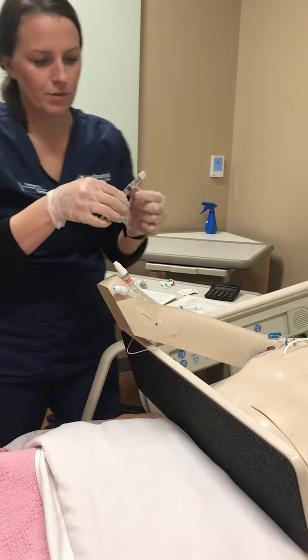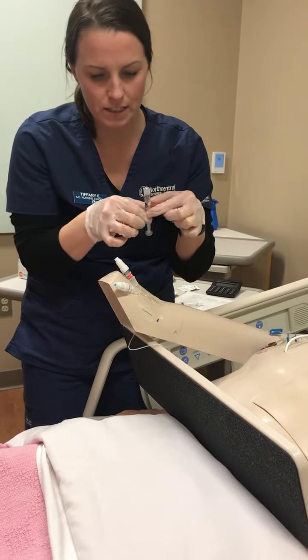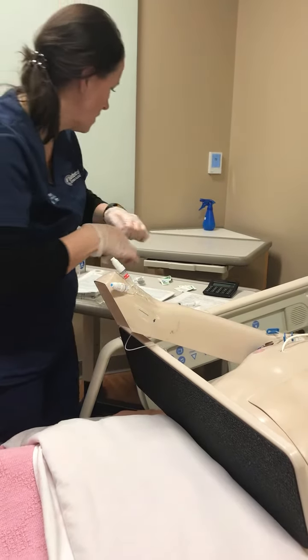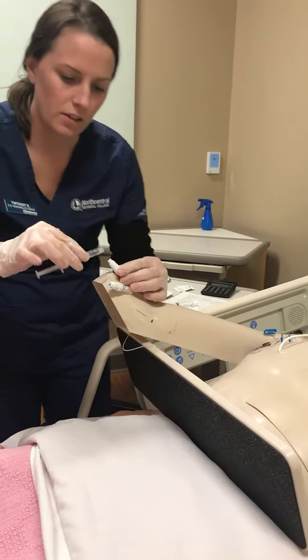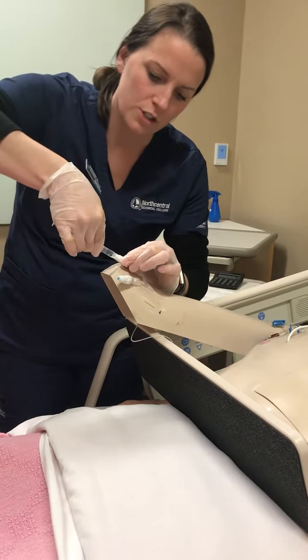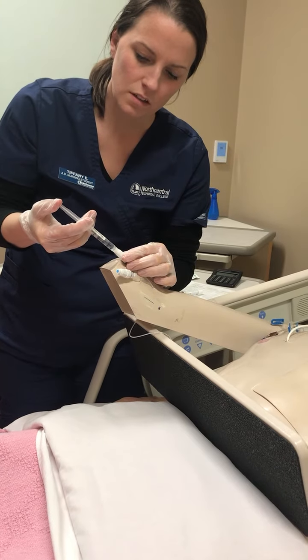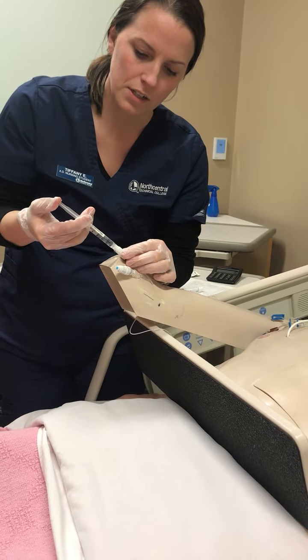And then I can go ahead and give my medication really quick. Zofran, 1.6 milliliters. Alright. And I can go ahead and attach this. And again, I want to deliver this over 2 to 5 minutes, so I'll go ahead and administer that.